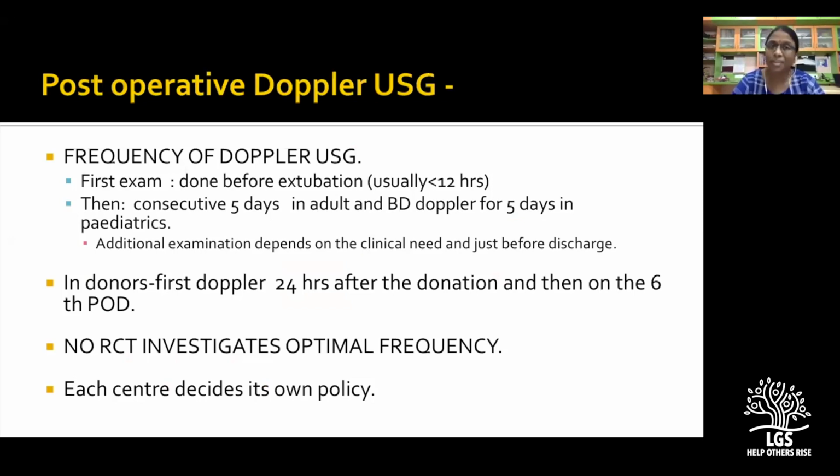Postoperative Doppler is a bit difficult because of the technical limitations. We cannot expect a perfect positioning from the patient, and also a lot of surgical bandage will give us only a limited window to do the Doppler, and the body habitus also decides the quality of the imaging. And we have to follow the sterile precautions. We have to use the sterile gel.